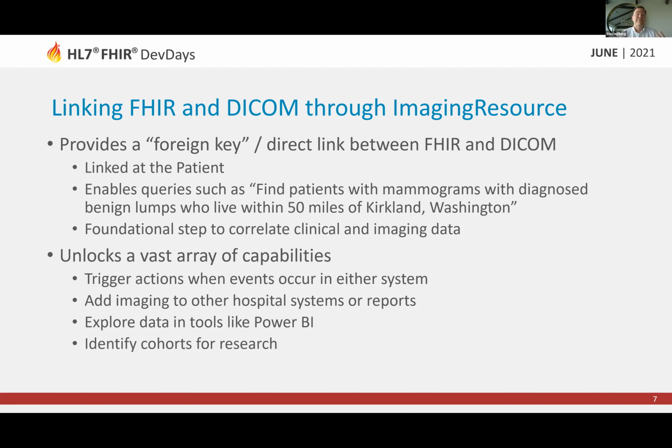I'll give you my favorite example. I was talking with a radiologist and said, I just don't get feedback from customers. I actually have it on another slide. I actually don't get feedback from doctors because I'm a teleradiologist on whether or not my observations, my diagnosis was correct. I'd love it if when I sent back my diagnosis to their DICOM server in the hospital, that when the biopsy came back or when the doctor looked at it and made a final determination, the physician, that I would get some kind of feedback packaged up.